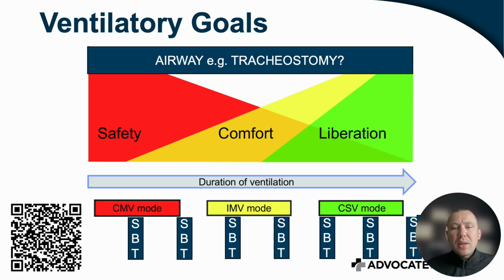And here is just a reminder that every patient's mechanical ventilation is a journey. We always start with safety, and pretty quickly, within usually 48 hours or so, we can transition into comfort, like the patient who was intubated for pneumonia. After pneumonia starts getting better, prioritizing patient comfort will let you decrease the amount of sedation that patient is getting. And as soon as patient is ready for the comfort mode, spontaneous breathing trials can be performed on a daily basis to understand whether your patient is able to be liberated from the ventilator and actually avoid tracheostomy if possible.